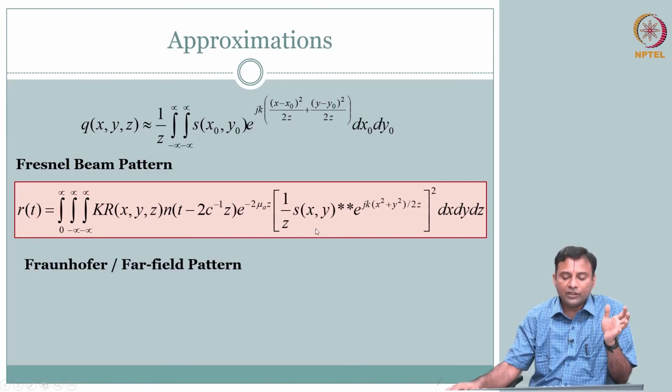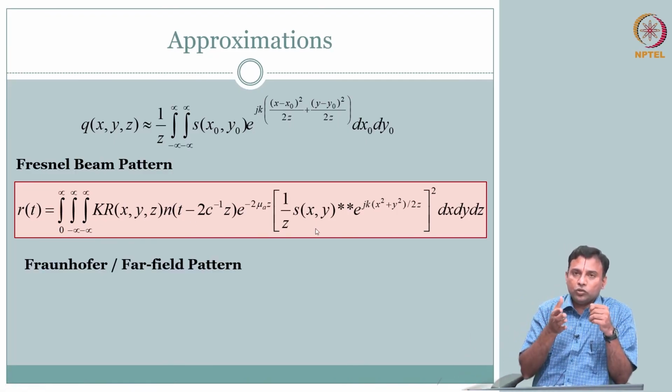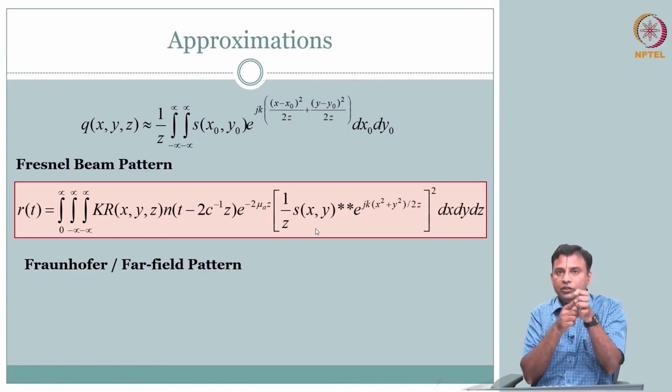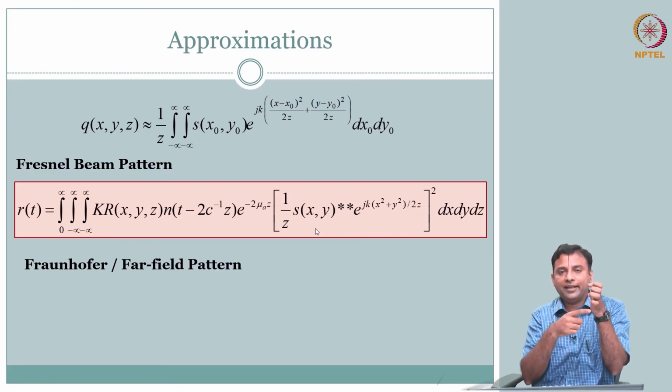What you have to recognize from here is, if you are close to the transducer, so this is the face of your transducer, and this is your depth, not only do you get the effect of this point, but you also get the effect from the neighbors, the corner points as well.